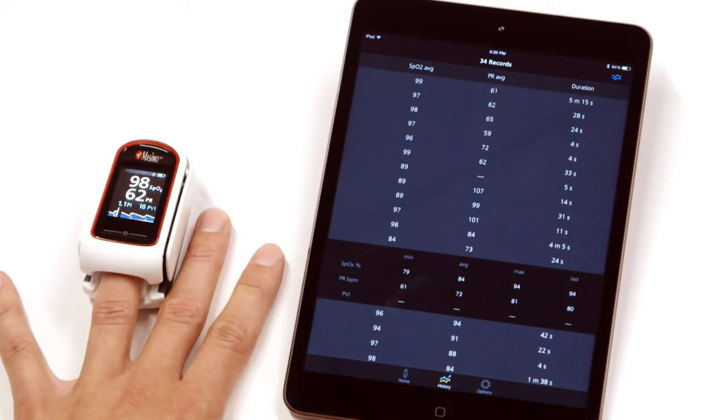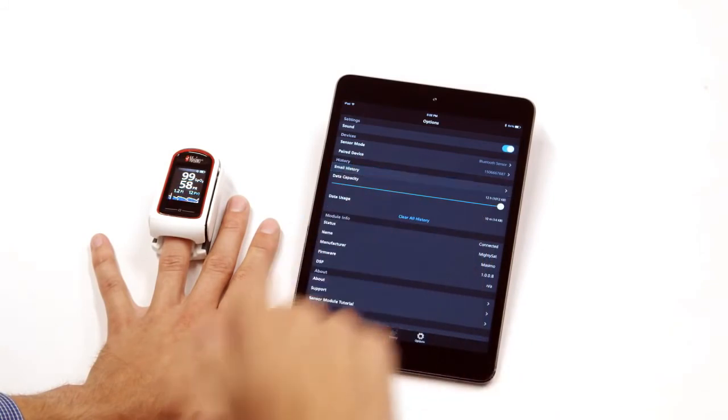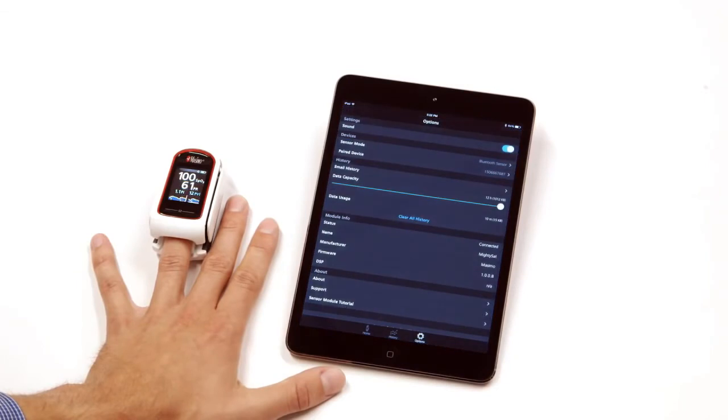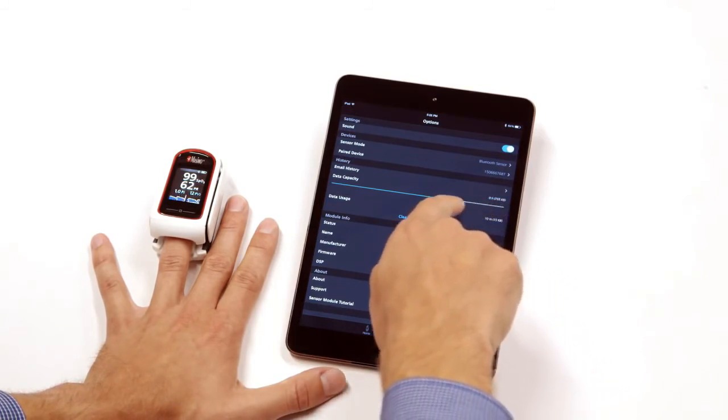Tap on each individual record to see additional detailed information, including minimum, average, maximum, and last readings for SpO2, PR, and PVI. Tap the Options icon and tap Email History to send the data of the selected record via email. To increase or decrease the time scale for recorded measurements, swipe the blue slider to change the data capacity.